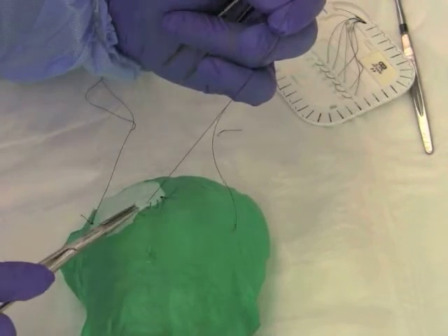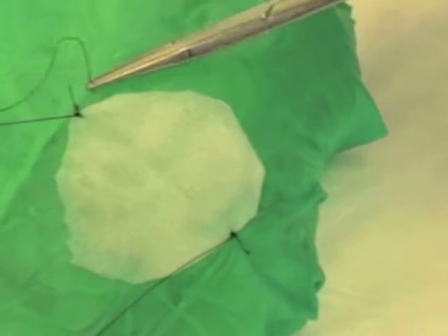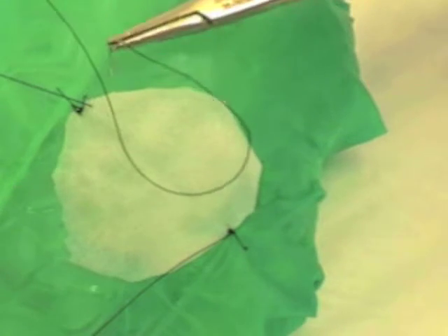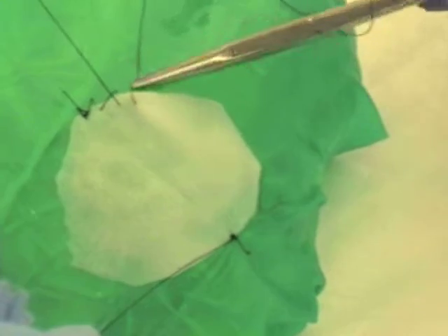Here is another view of that same technique: putting the stitch through the edge of the dura, then through the dural substitute, pulling it through while maintaining tension at the base. As you can see, the stitches are evenly spaced and care is used to not injure the cortical surface below the dural substitute with the needle edge.